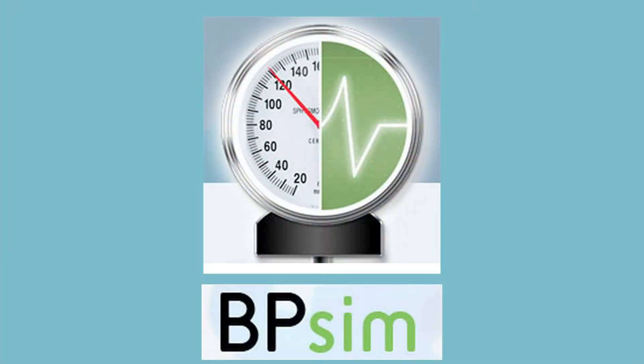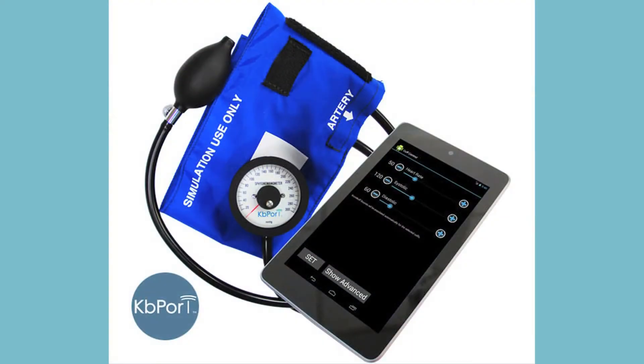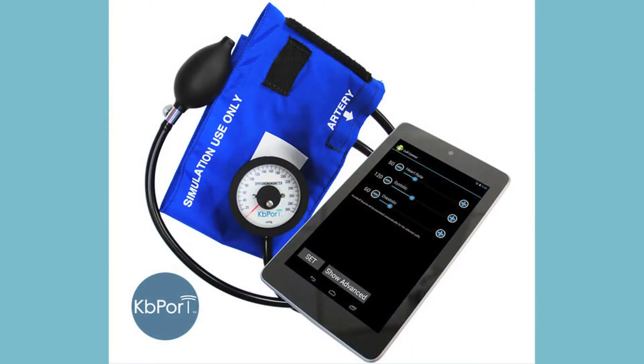It's a simulated blood pressure cuff that actually allows you to duplicate the real sounds of a blood pressure cuff — all five sounds — and be able to do variable rates.